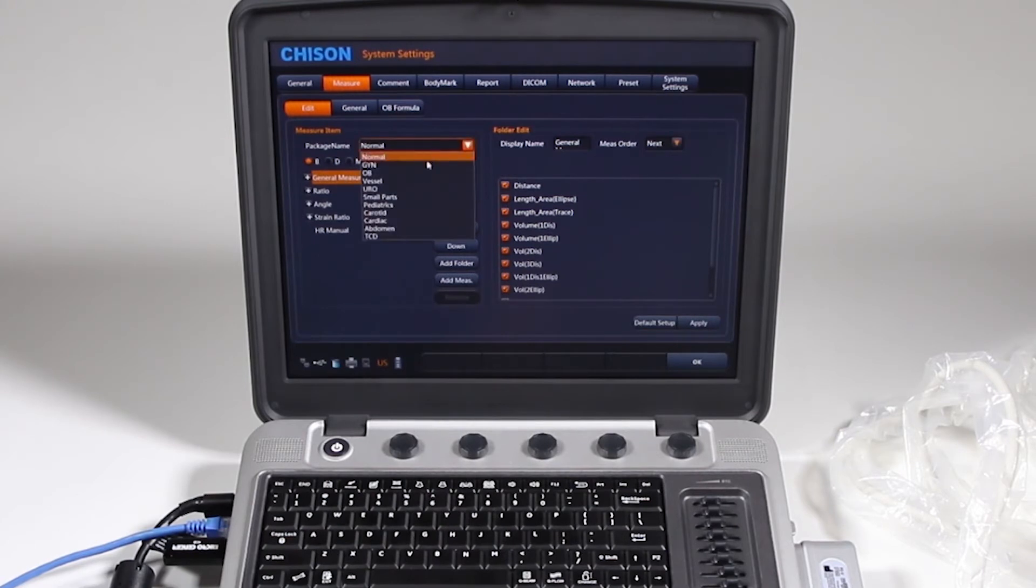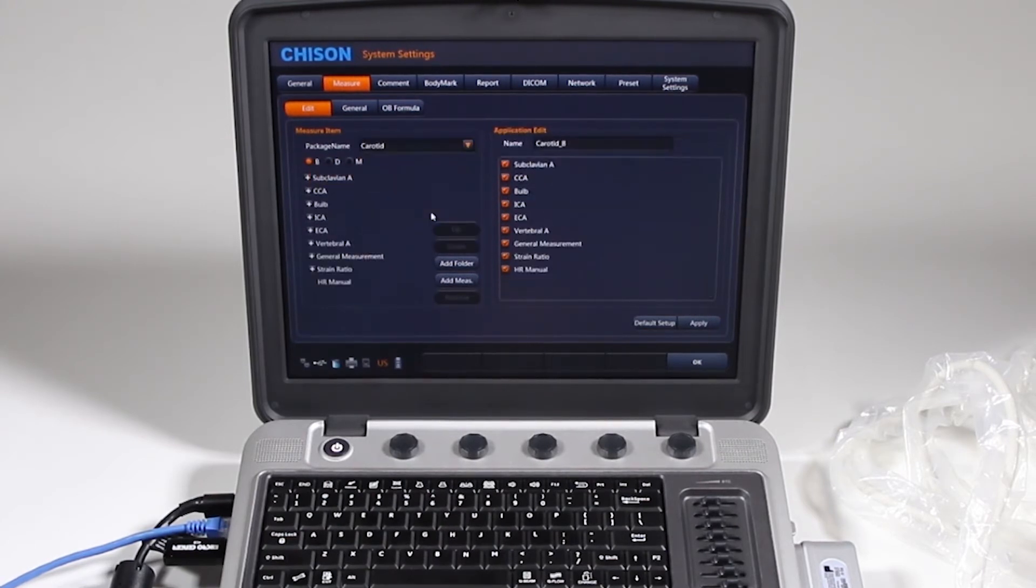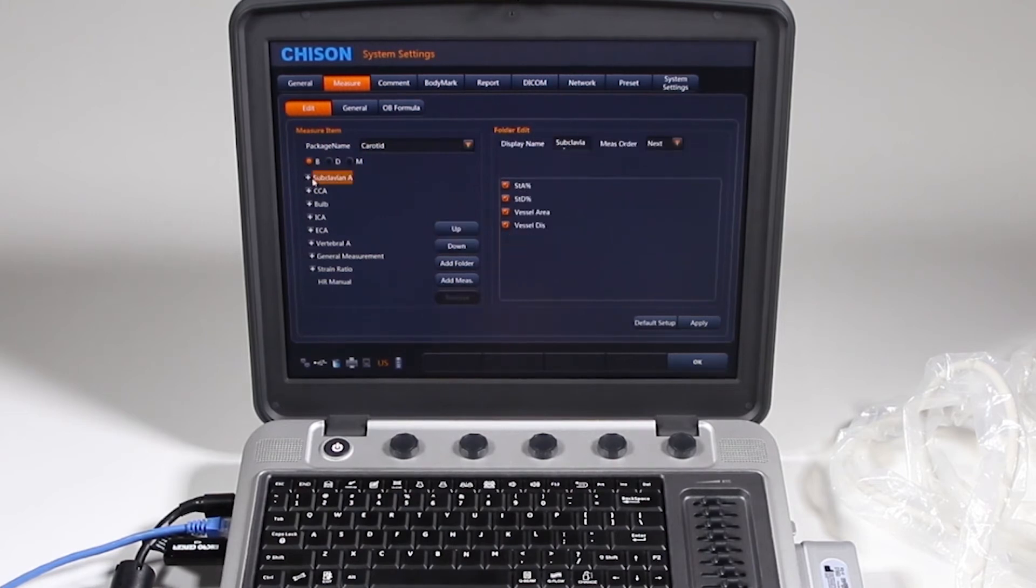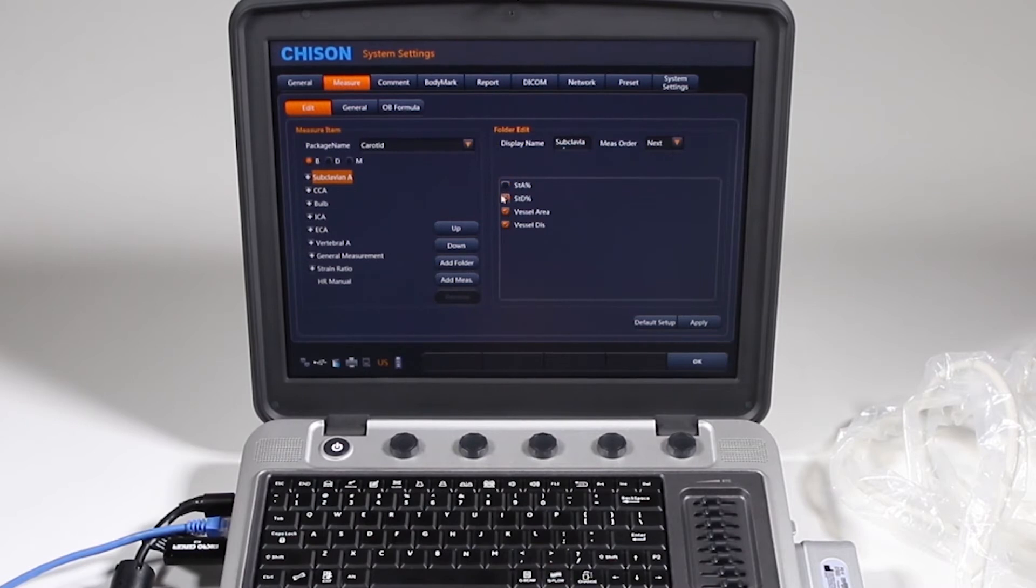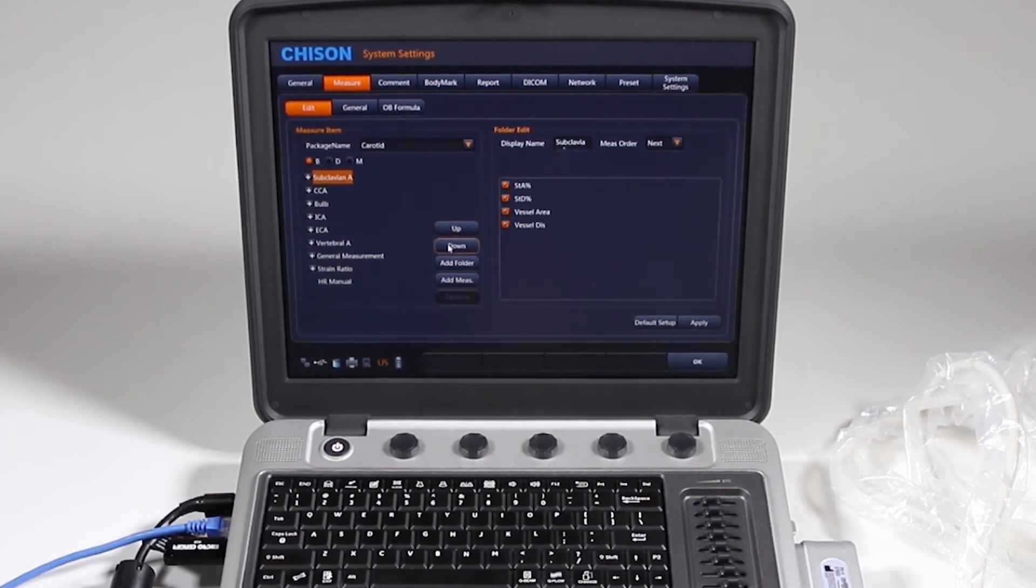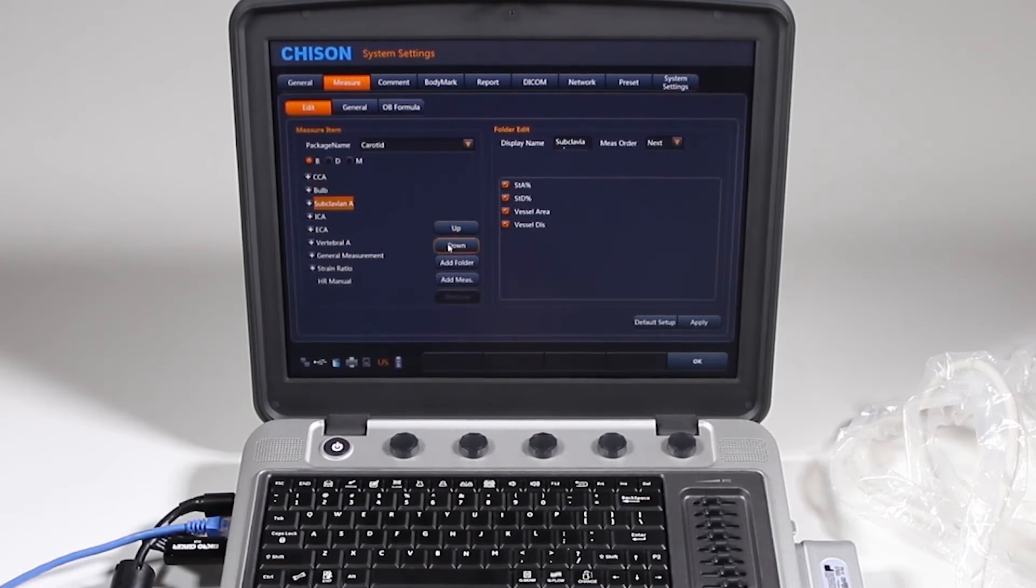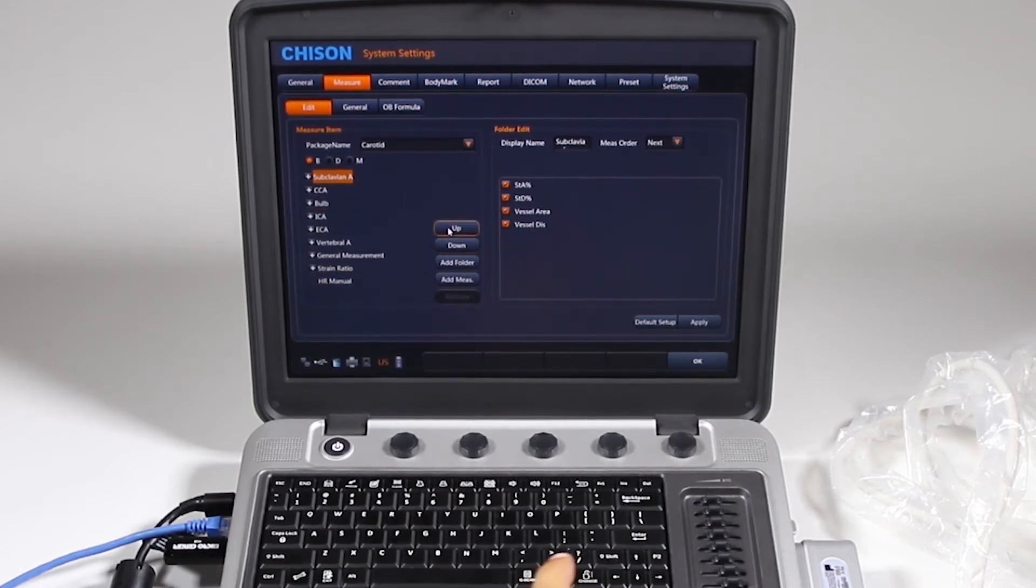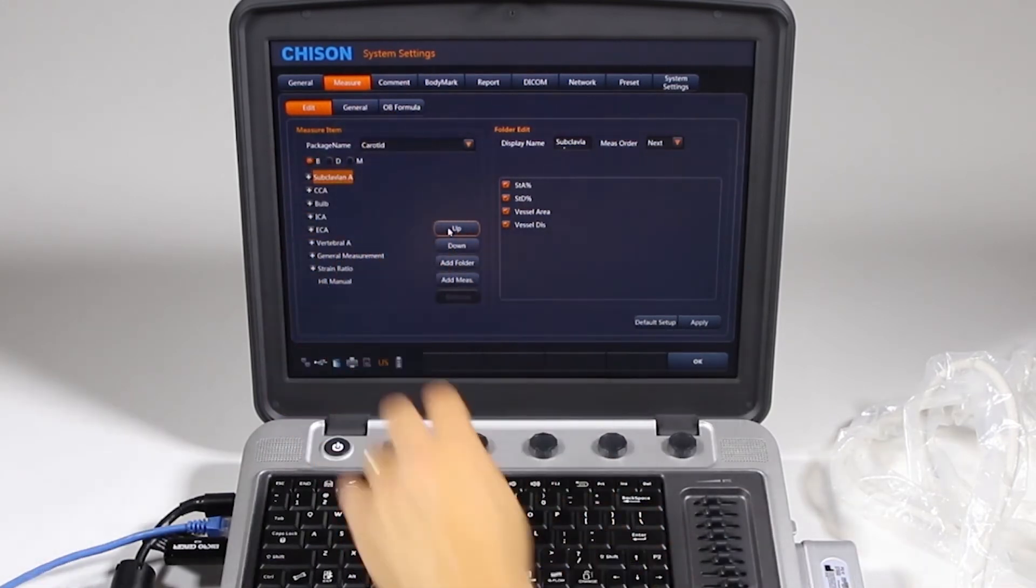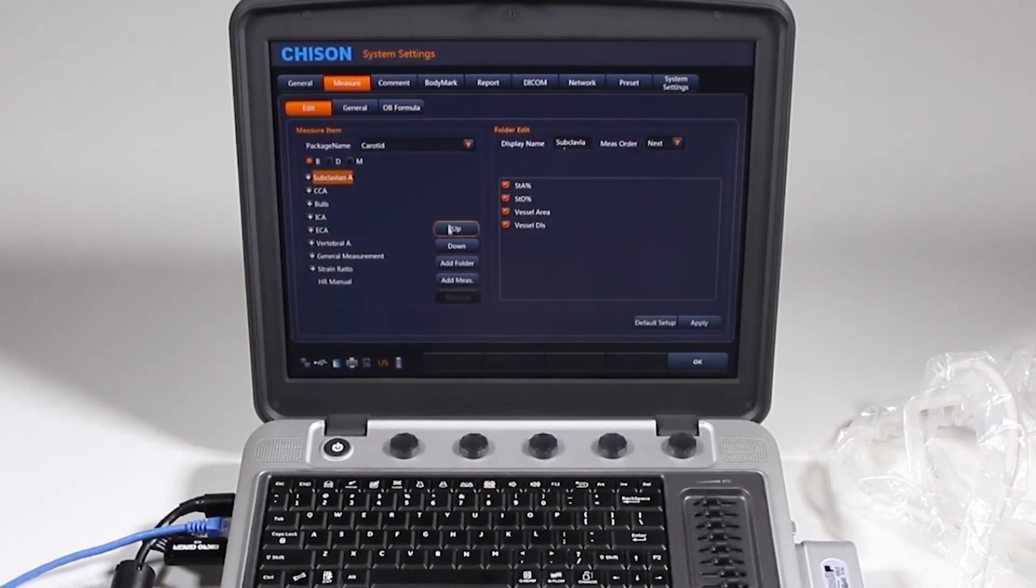I don't want this subclavian artery on my B, I can just uncheck these and have various things not appear on the menu. This is where you'll add it or remove it, I can move them up or down on the menu. This is exactly how it will appear when you hit the calc button on screen, that's how that menu will appear.